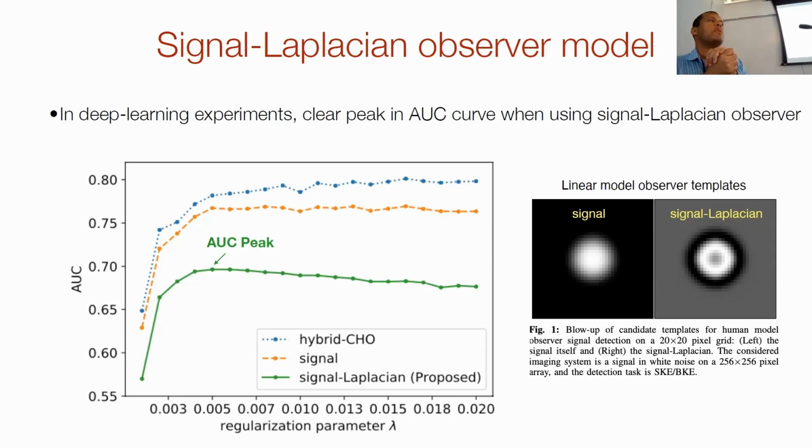If I have a 500 unit contrast, it's very challenging if it's 1 millimeter, I have a hard time looking at it. If I have a 10 centimeter object with the same 500 unit contrast, I have no problem seeing it at all. You're talking about really small compared to different sizes, but once you get to a certain radius, it's going to be about the same. I don't know.